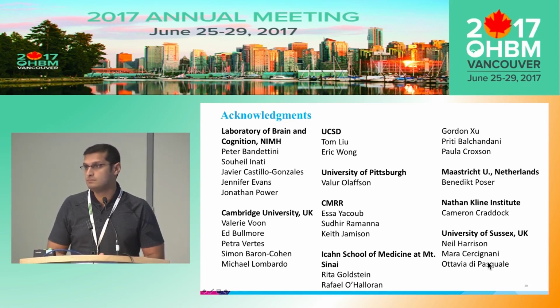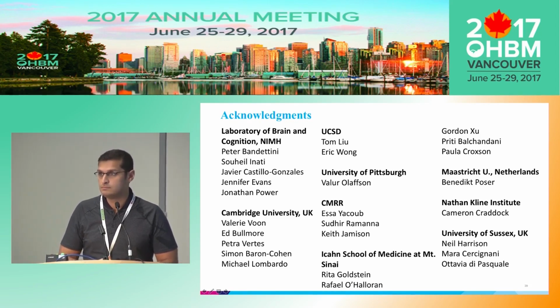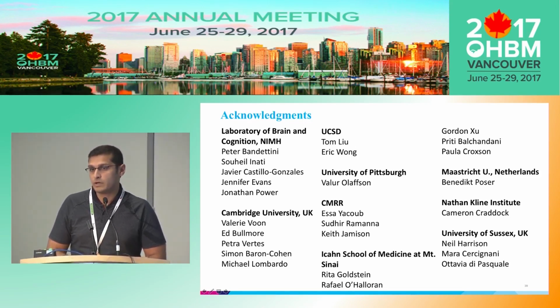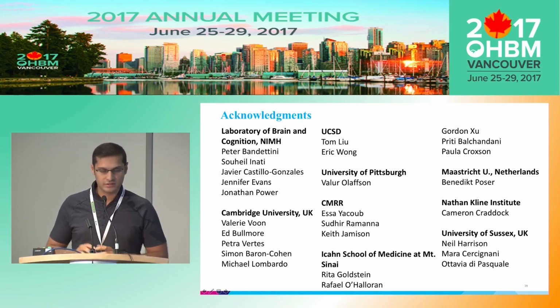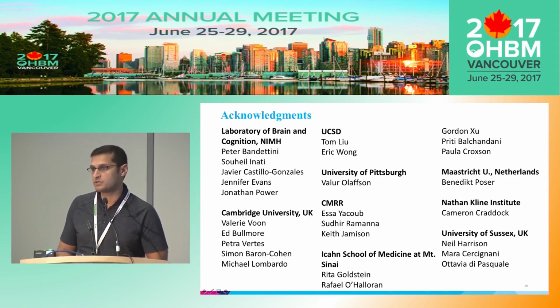Hi, thanks. Just wondering, you showed all the networks that you get out of MEICA. I'm wondering, do you see other components that may not be so neural in origin? Oh yeah, you got loads. I only showed the BOLD ones. But the types that you get under the non-BOLD regime include cardiac pulsation, drift, loads of head motion, and also GRAPPA artifacts, acceleration artifacts. Those are all under the non-BOLD regime.